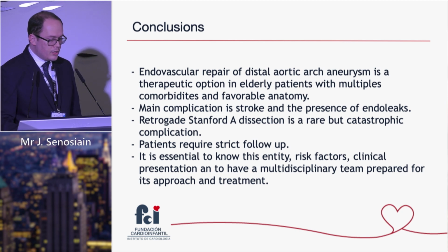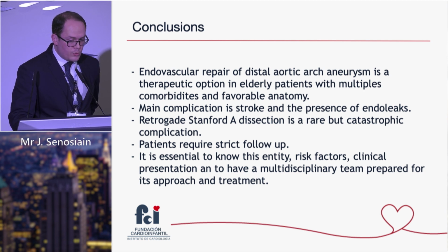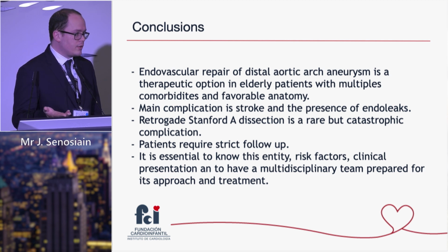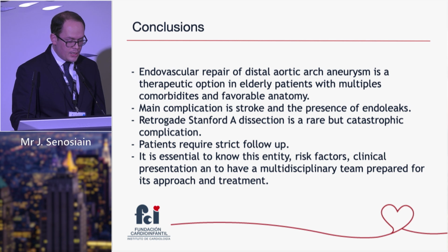So in conclusion, the endovascular repair of distal aortic arch aneurysm is a therapeutic option in elderly patients with multiple comorbidities and favorable anatomy. The main complications are stroke and the presence of endoleaks. The retrograde Stanford A dissection is a rare but catastrophic complication. Patients require strict follow-up with strict CTA controls, and it is essential to know this entity, the risk factors, the clinical presentation, and to have a multidisciplinary team prepared for its approach and treatment.